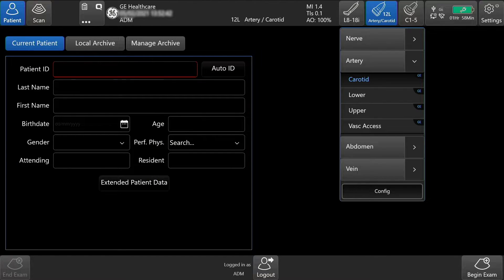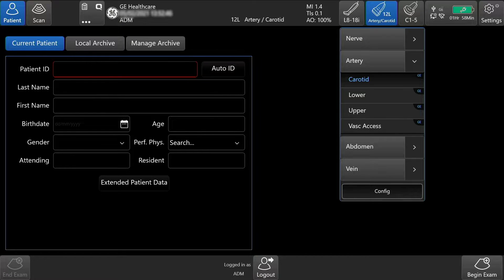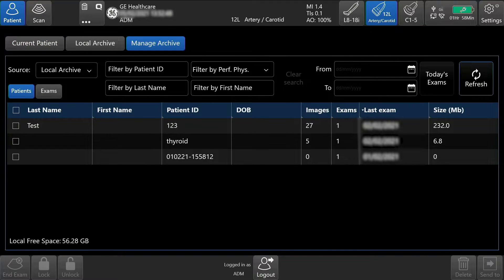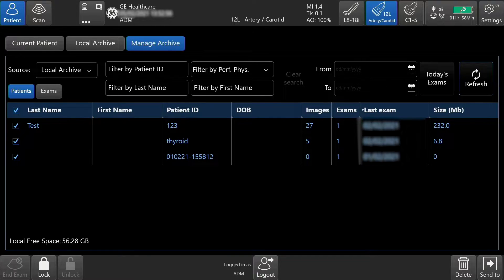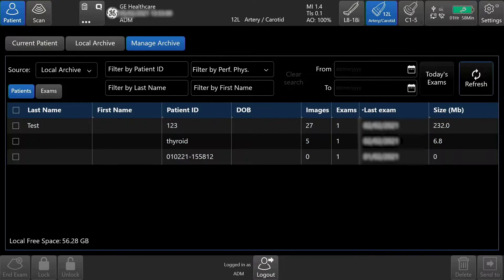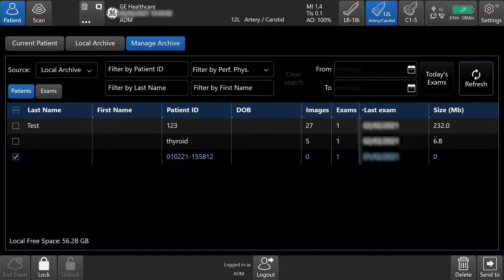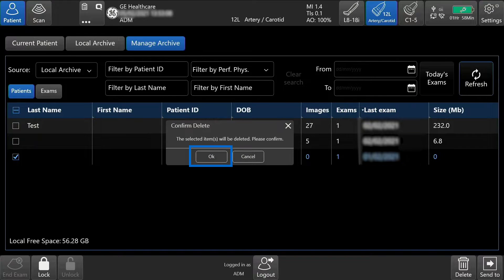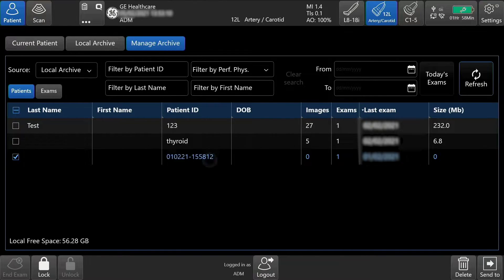To manage the archive, tap Manage Archive from the patient screen. Here you can delete exams from the hard drive by tapping the top box next to the last name to select all, or you can tap the boxes individually. Once selected, tap the Delete button on the lower right-hand side of the touch screen. Select OK to permanently delete your exams.